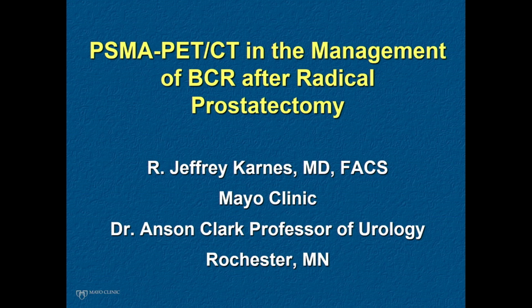I completely agree. If they were considering radiation, most times the radiation oncologist would want that node biopsied to determine whether they would increase the field. So I guess this is important information. First, advise your patient about the potential result of the PSMA PET CT scan, and that you might detect a solitary lesion or maybe an oligometastatic disease.